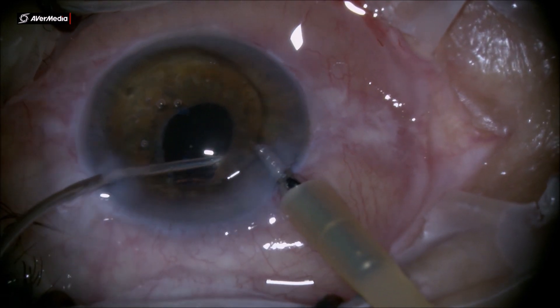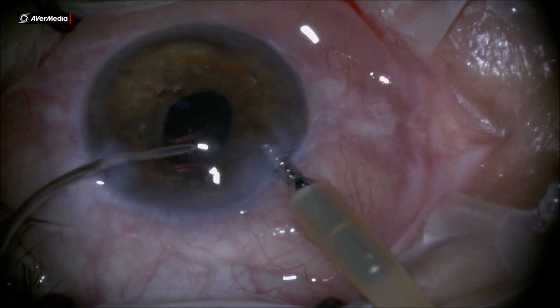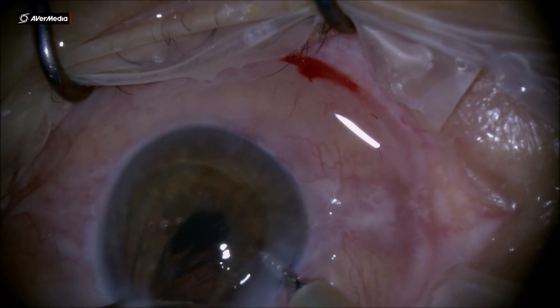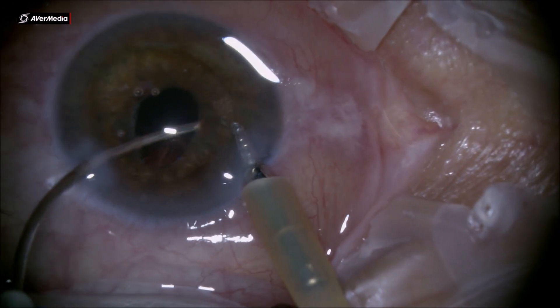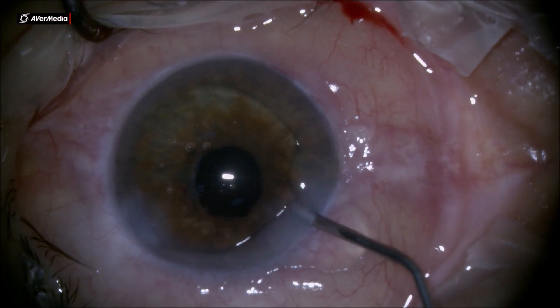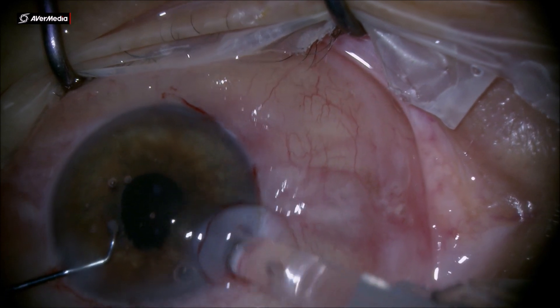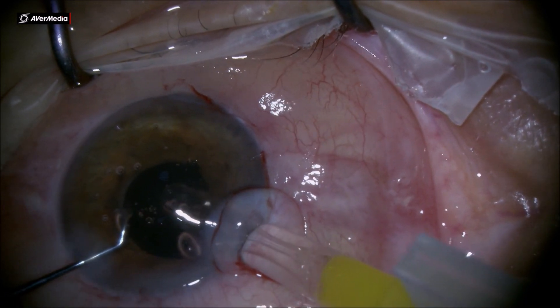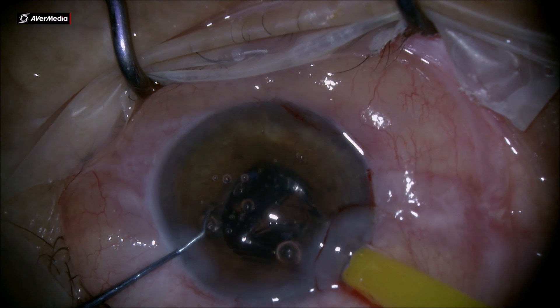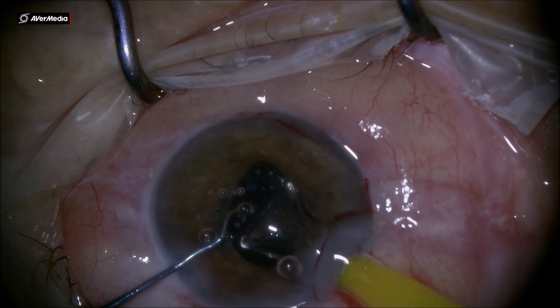On top of every problem you can get in these cases, I got one more: injecting the IOL, the plunger got stuck and the silicone tip couldn't advance anymore. So I had to pull out the chopper from the eye, hold the injector with the left hand, pull back the plunger and push it back in — and in this way the silicone tip from the plunger got released so I was able to insert the IOL inside the eye.